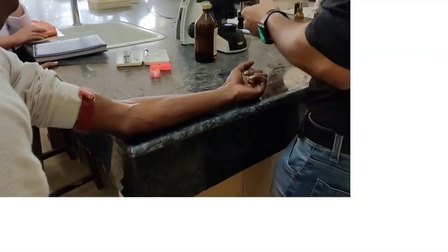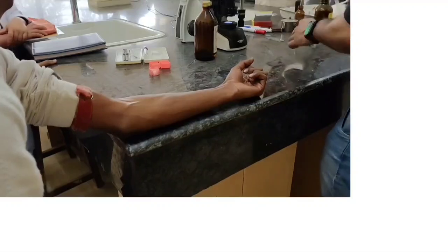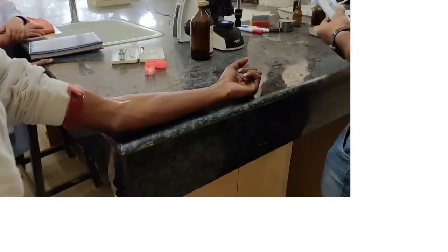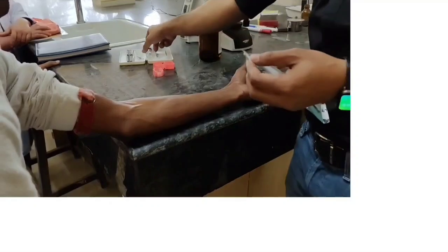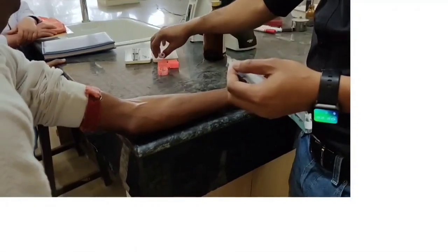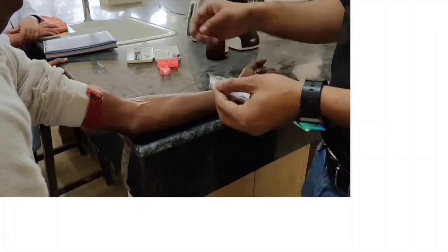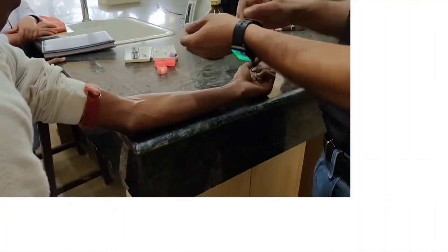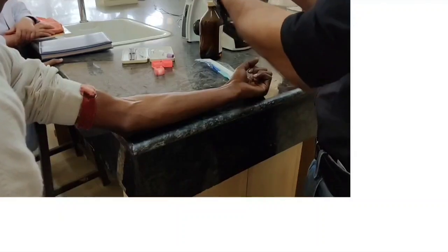We have already used spirit swab to clean the area, and we have to wait for it to dry completely, and then we can draw the blood. A sterile needle or a sterile syringe we are going to use to draw blood. Let's see.